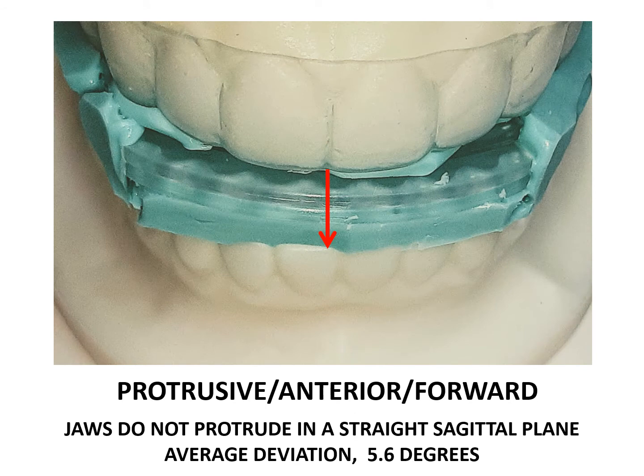One-dimensional, pull-forward jigs that mechanically restrict translatory movement do not replicate biophysiologic movement. Mandibular positioning at 60% of maximum protrusive is arbitrary, unscientific dogma. A study I published in 2012 in Sleep Diagnosis and Therapy, reprints of which are available on the website, showed that condylar asymmetry exists 95% of the time.